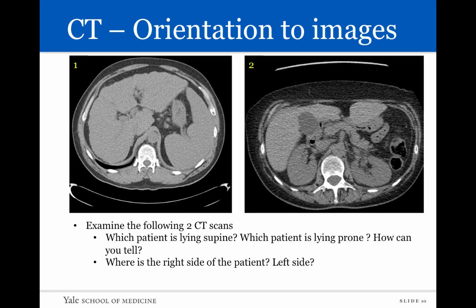Now let's orient ourselves to CT images by looking at CT images number one and number two. Try to answer the following questions: which patient is lying supine, which patient is lying prone, how can you tell, and what is the right side and what is the left side of the patient?